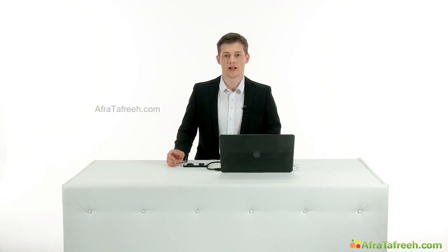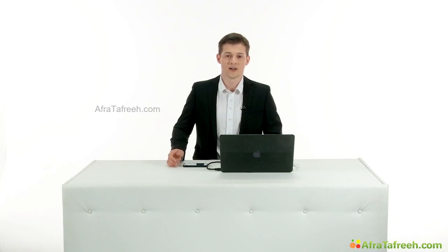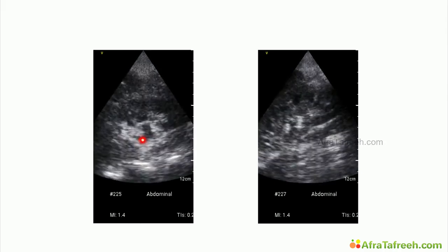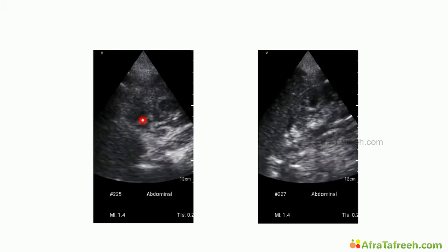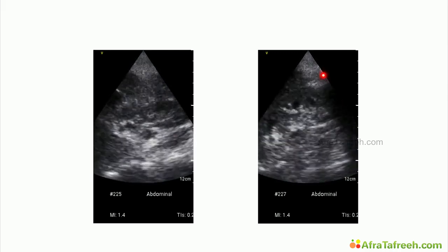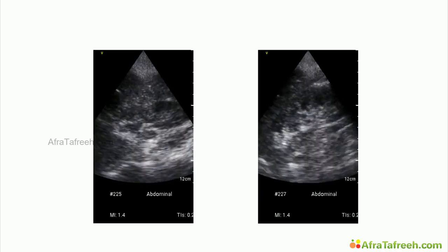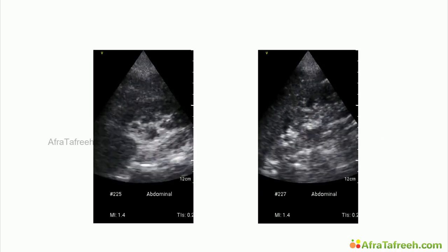The problem of a renal pelvis calculus is that it is nearly not visible with ultrasound, even impossible to visualize with point-of-care ultrasound. To see the difference in between the pathologic kidney and the normal kidney, here is her left kidney with the dilatation of the renal pelvis and the dilatation of the renal calyces, compared to her completely normal right kidney with no dilatation of the renal pelvis or the renal calyces.